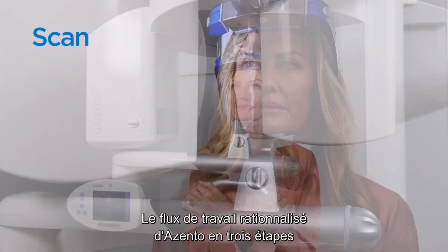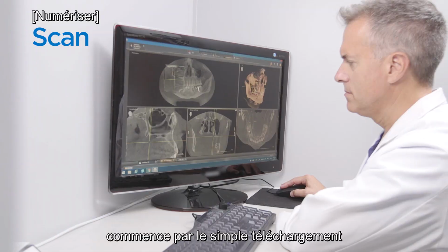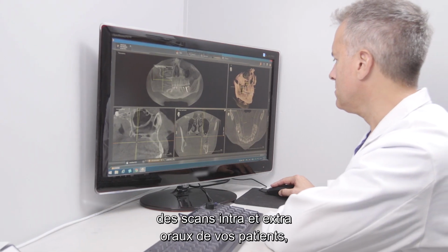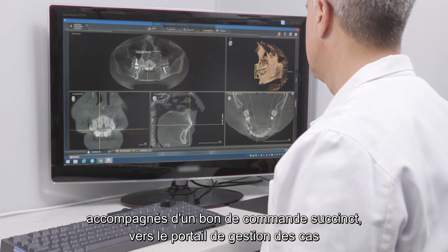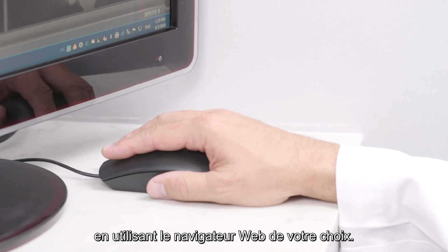The streamlined three-step Azento workflow starts by simply uploading your patient's intra and extraoral scans, along with a brief order form to the case management portal using any web browser.